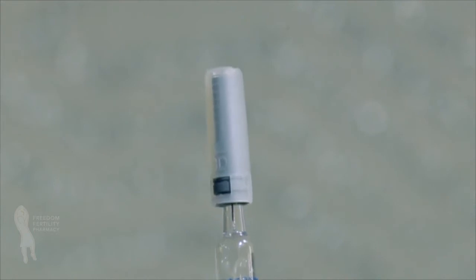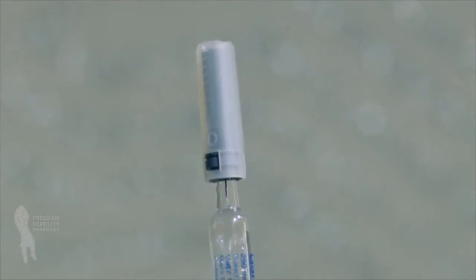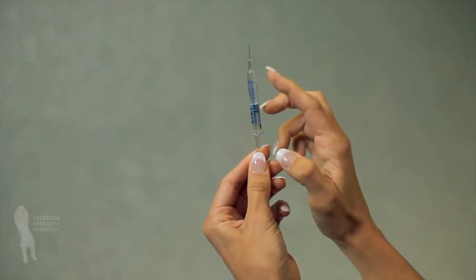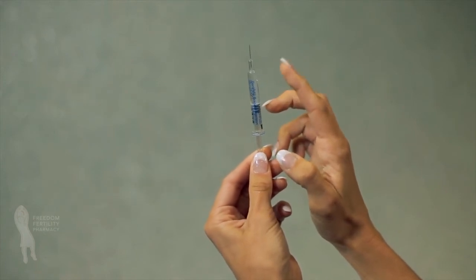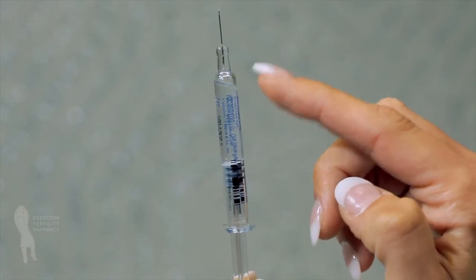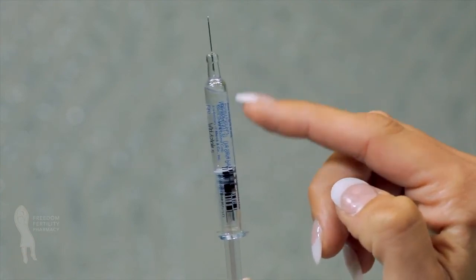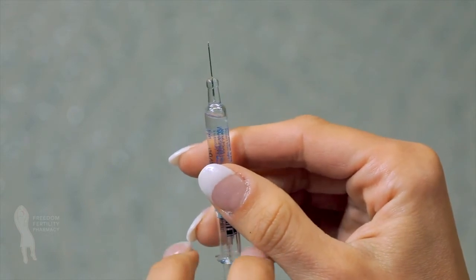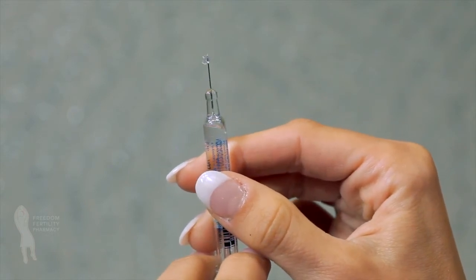With the needle pointing upward, carefully remove the needle cap from the syringe. Do not touch the needle or allow it to touch any surface. To remove any air bubbles, point the needle up and gently tap on the syringe until all the air bubbles rise to the top. Push the plunger carefully until a small drop of liquid begins to appear at the tip of the needle.